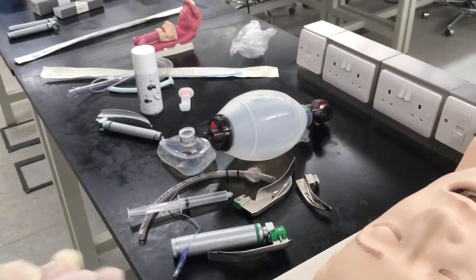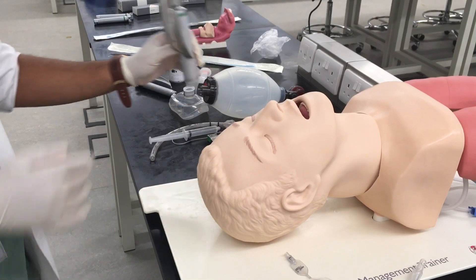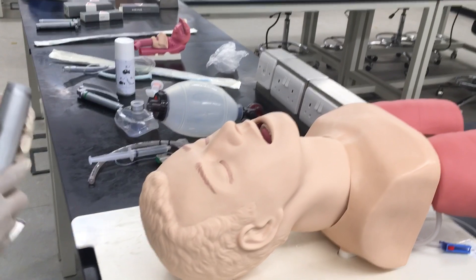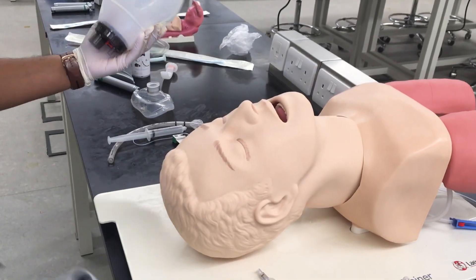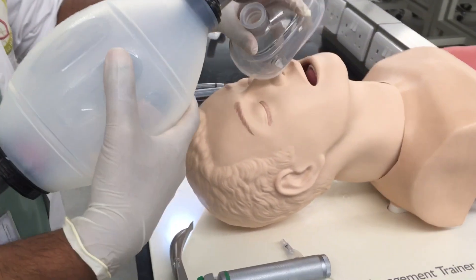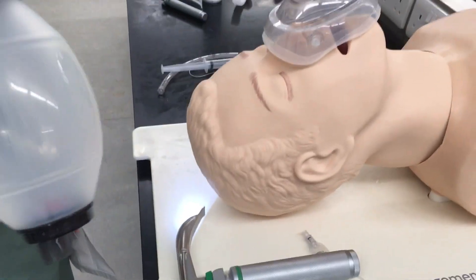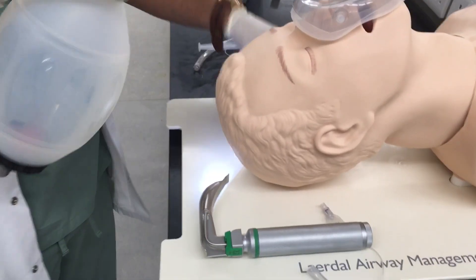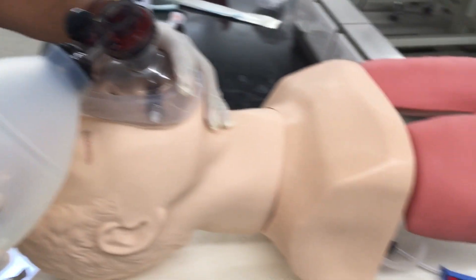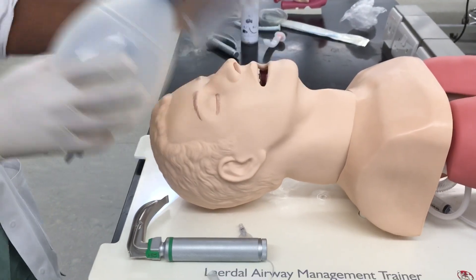An important point before you do the intubation is to pre-oxygenate the patient. Hold the mask in the C-position and ventilate the patient for about three minutes.